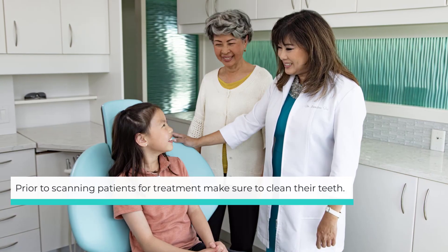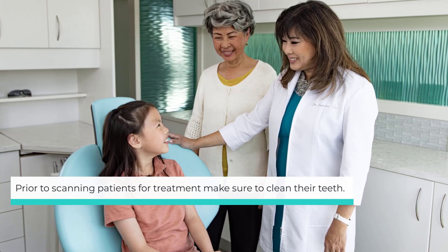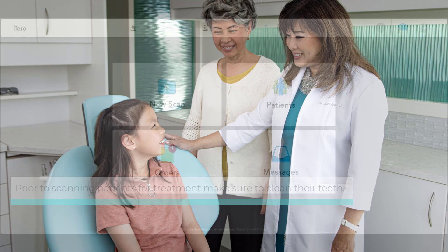Prior to scanning patients for treatment with Invisalign Palatal Expander, clean the teeth thoroughly to remove plaque around the gum line and expose as much of the tooth's crown surface as possible.